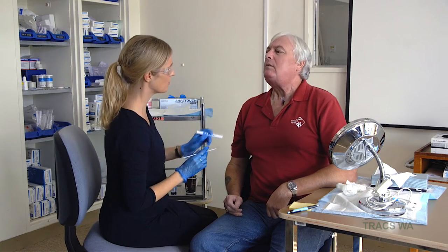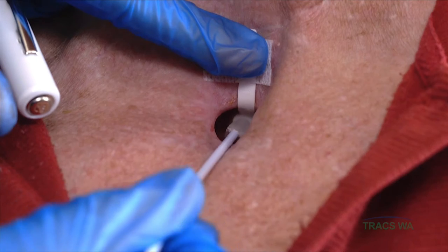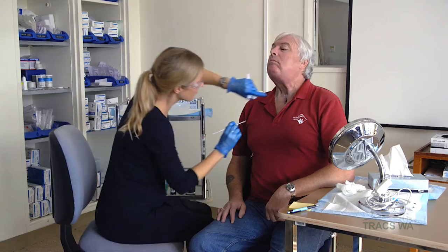That's a bit better. So you've got a little bit of voice now. Is that your normal voice? No, yeah, it still sounds effortful. Okay. I'm going to have another go because it seems to have made a bit of a difference. Give that a try.